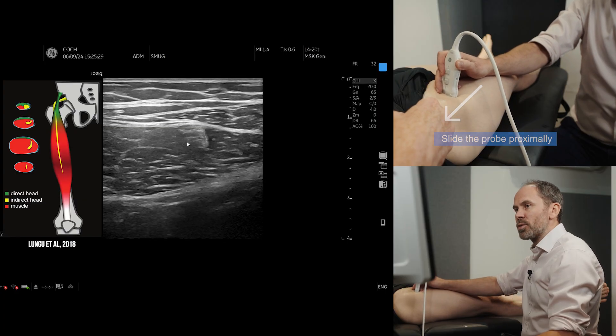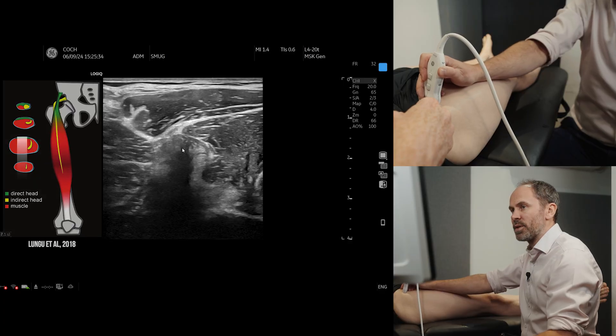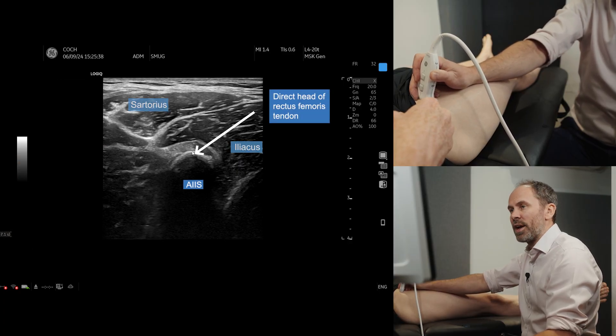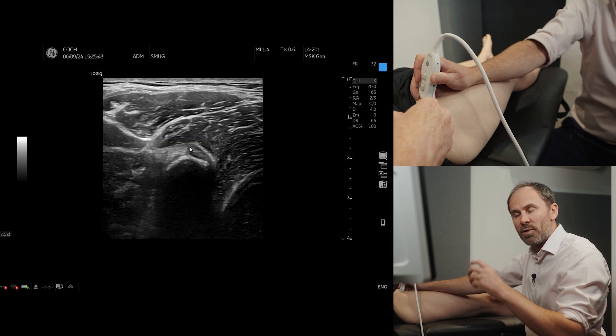As we move up, the best thing to do at this stage is follow it all the way up and find out where it's going to. And it's going to there, which is the hyperechoic region, which is the AIIS, and you can see the direct head on top of that, which is the direct head of REC-FEM.